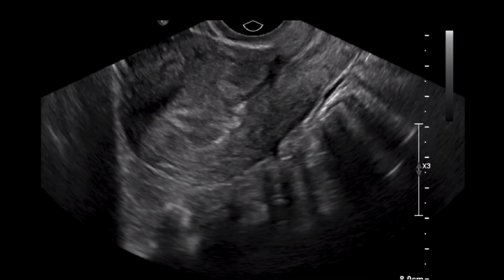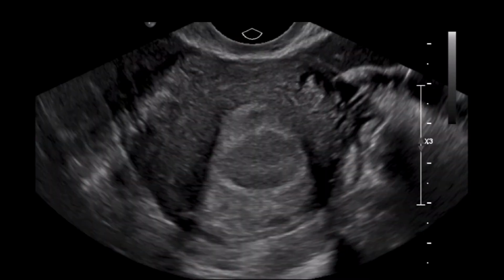For those of you newer to ultrasound, you can identify this as a screenshot from a transvaginal ultrasound based upon the shape of the probe at the top of the image, as well as the higher resolution offered by the higher frequency probe. In this clip, a sagittal or long axis view of the uterus is identified. Similar to the transabdominal images, no evidence of an intrauterine pregnancy is identified within the uterus, which I highlighted in red for easier identification. The probe was subsequently rotated to the patient's right, giving a transverse appearance to the uterus. No free fluid or concerning abnormality is identified. Again, no structure within the uterus is identified to represent an intrauterine pregnancy. In this orientation, the more circular appearance of the transverse uterus is highlighted in red.